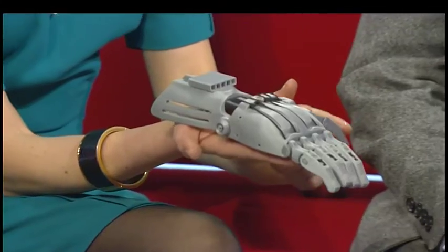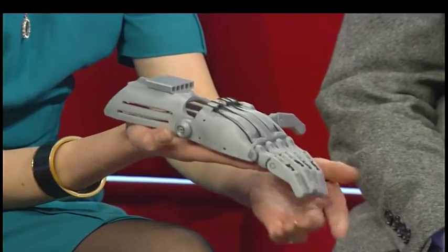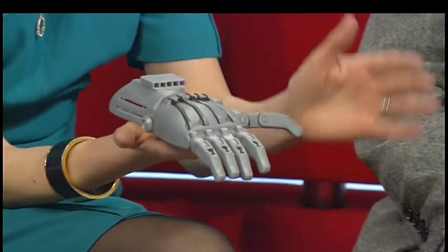Now take a look at this. Isn't that fantastic? It is a prosthetic hand. You can see its fingers moving there. But it's been made in a very different way.